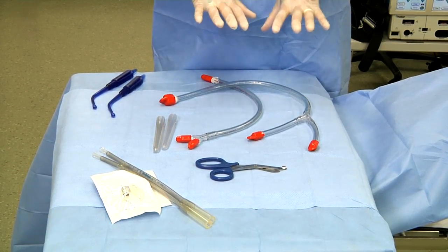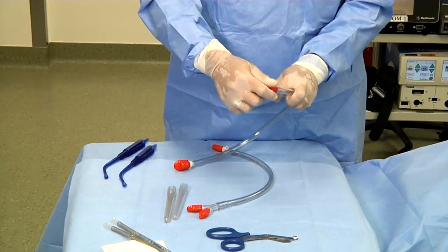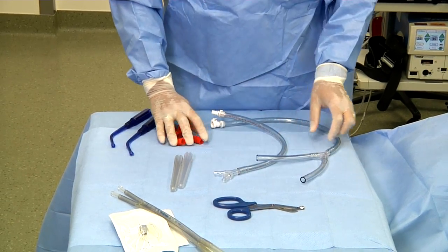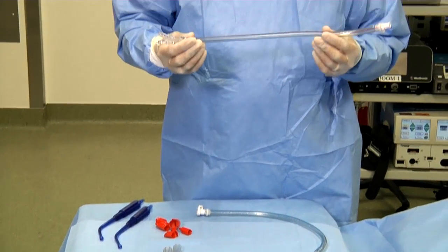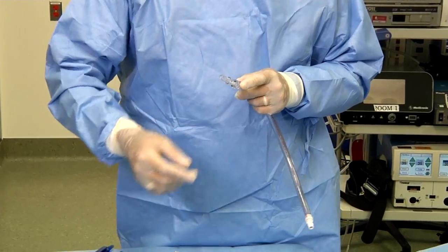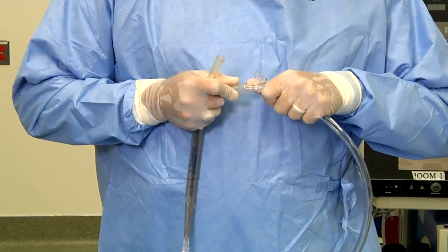Now we'll assemble these to place them into the patient. The first step is to remove from the tubing all the red connectors, and those can be discarded. The inflow tubing will be assembled and is noted by directional arrows that are red to indicate the warm inflow fluid going into the patient. The wire reinforced catheters are each placed on the ends of the Y connector.